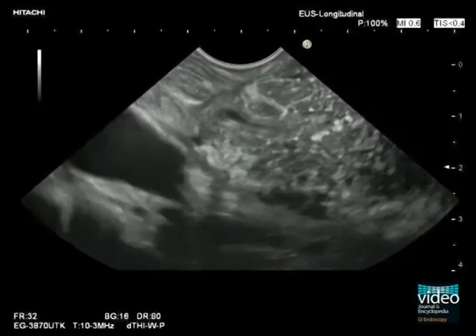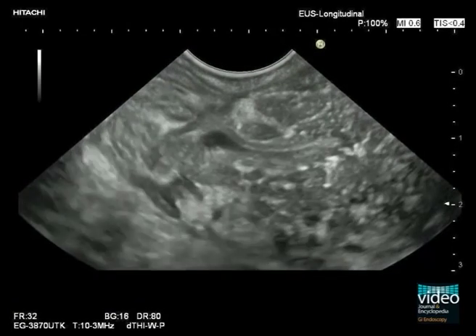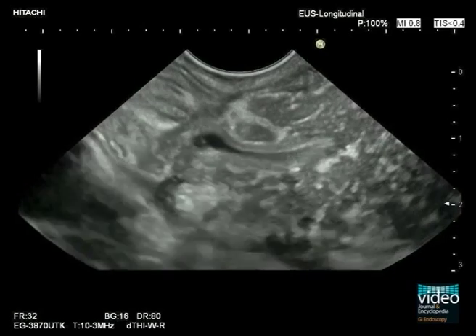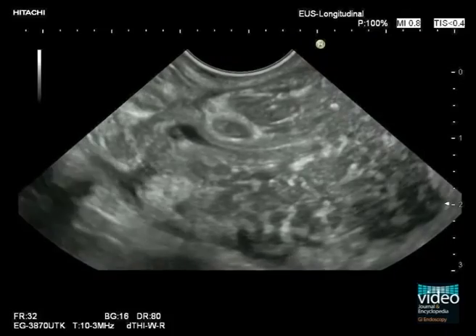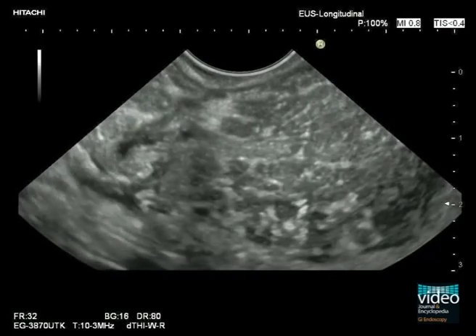In this case of acute pancreatitis of unknown etiology, a bile duct stone can be ruled out with longitudinal endosonography, and the lumen of the bile duct is compressed due to inflammation of the pancreatic head parenchyma. Following stepwise withdrawal of the scope, extensive peripancreatic effusions are visualized.